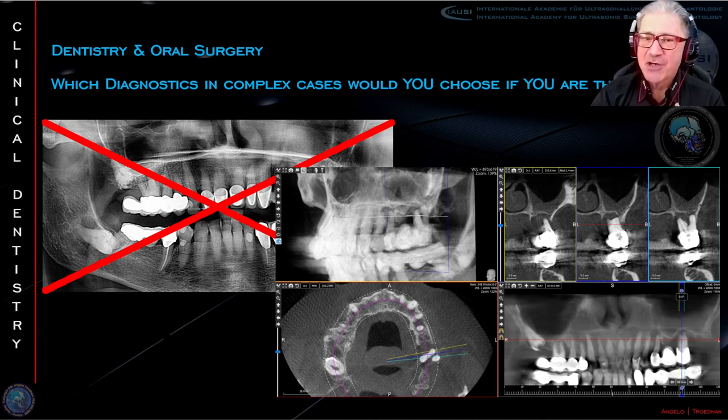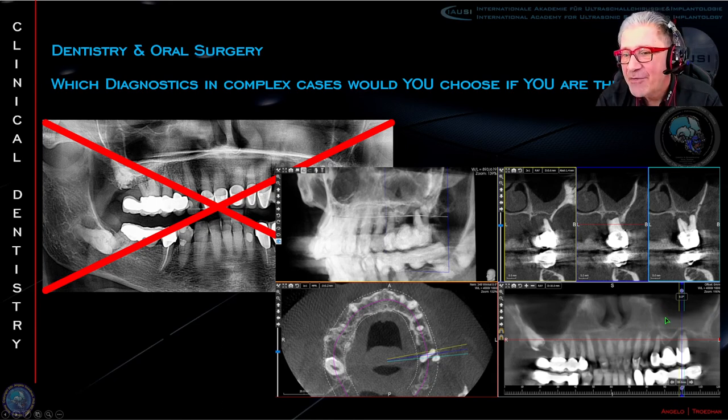So it's our obligation to serve our patients as best as possible and to avoid surprises to ourselves when it gets to the surgery. Just imagine, you were planning here a sinus lifting procedure without knowing that there is a very, very strong sinusitis that prevents you from doing sinus lift surgery. And when you say, yeah, here we can do tooth extraction and simultaneous implant insertion, and you do it and then you find out that you have a big cyst here, well, then you're in trouble.